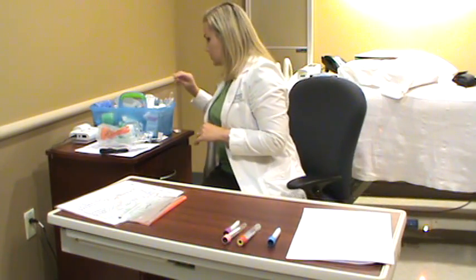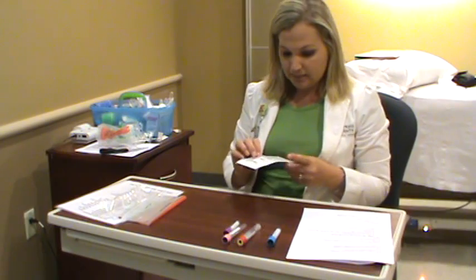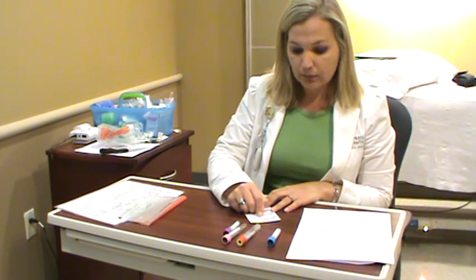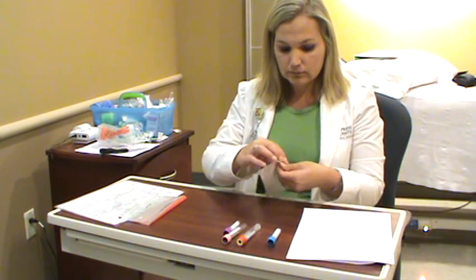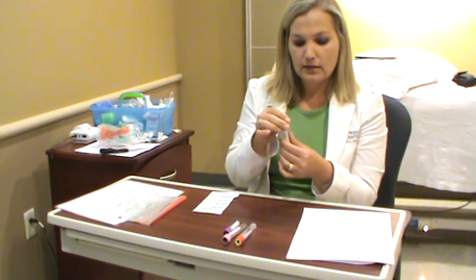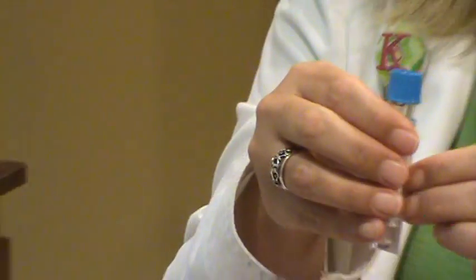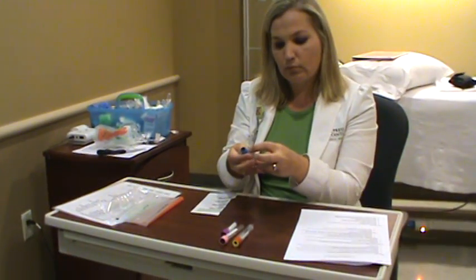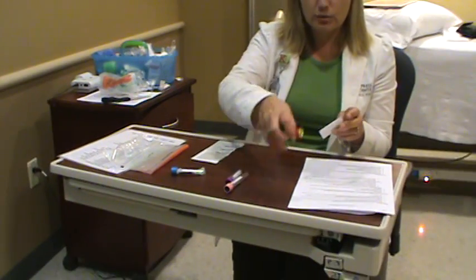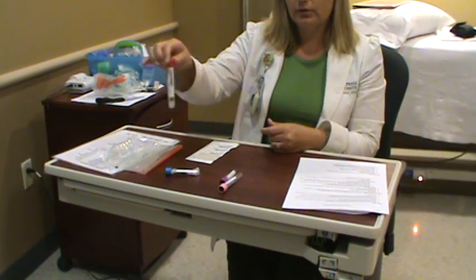For labeling, you want to label all your specimens at the patient's bedside. Use chart labels when available — go ahead and put it right on the tube before you even start. Write your initials, the date, and the time you're collecting it. When you apply the label, put it right over the existing label on the tube. We already know the tube type by its color. If you put it on sideways, we can't see the specimen to check for hemolysis or proper fill, so please put it straight over the label.